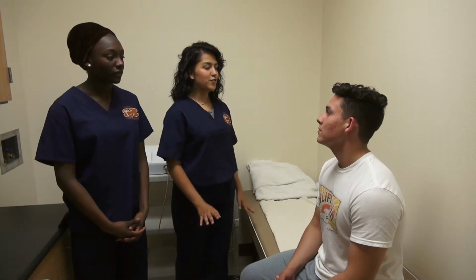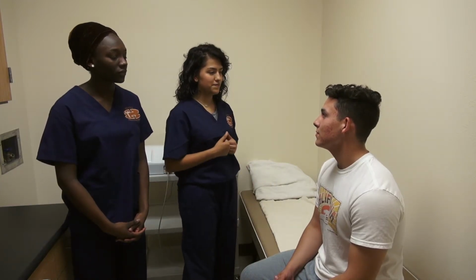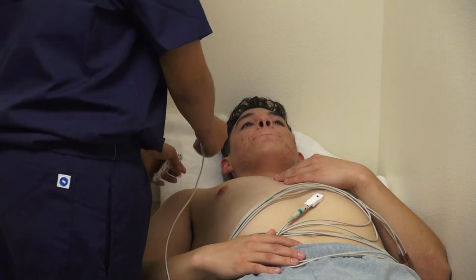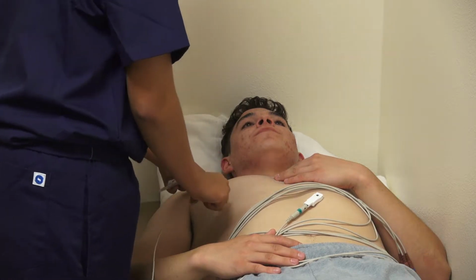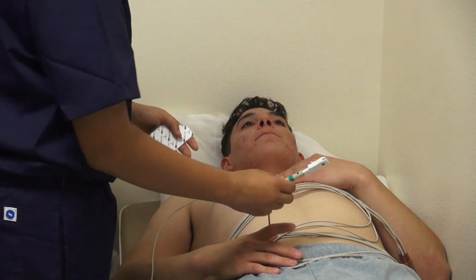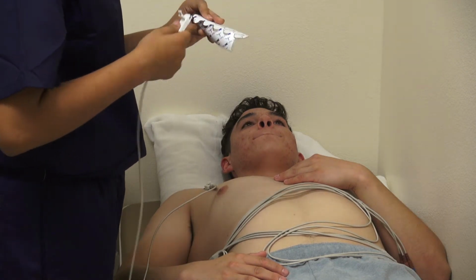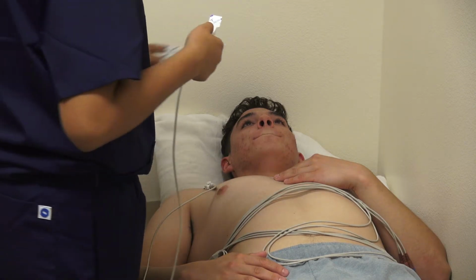Right. Okay, now if you don't mind, we're going to have you lay down, and you can either take off your shirt or you can lift it up. Right now, you'll have to place the limb lead, and the first one is the white lead, and you'll place that in the right shoulder area. The next limb lead is the green lead, and you'll place that in the right lower abdominal area.